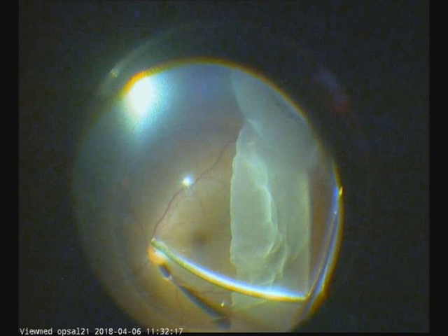Case 5. What is the pathology here? During vitrectomy, I'm just injecting perfluorocarbon. Yes, this is a giant retinal tear, which is more than 3 clock hours. Then it is a giant tear.